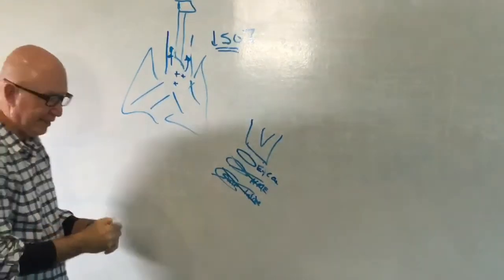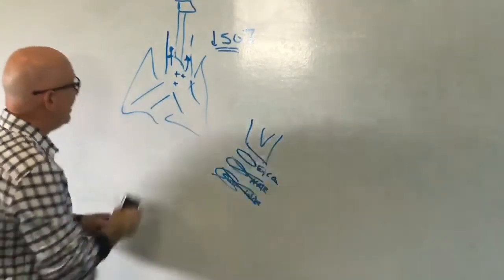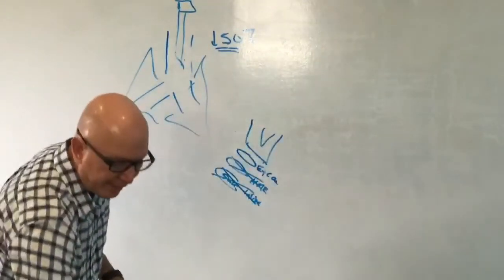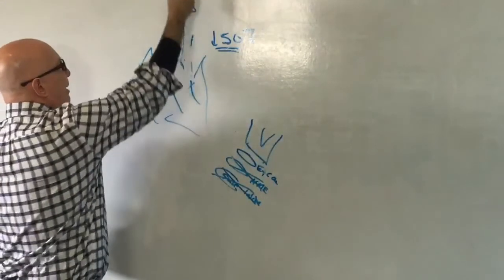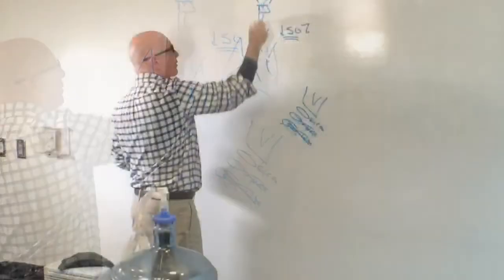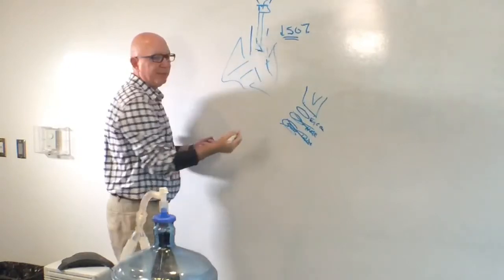But if there is a leak during the expiratory phase, then you actually have a pressure gradient from the mouth down to the distal tip of the endotracheal tube.